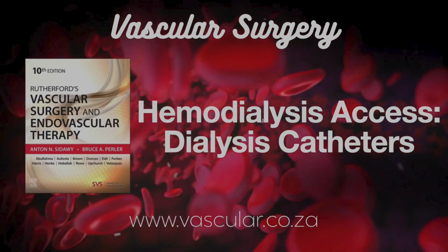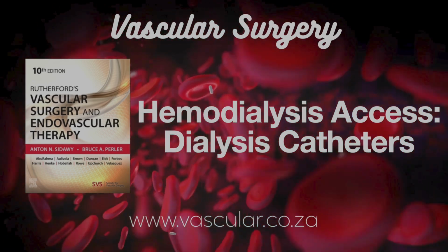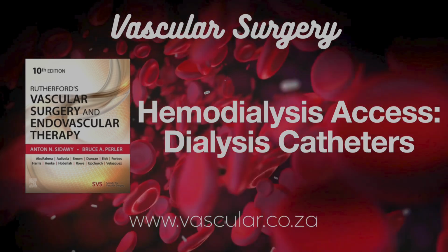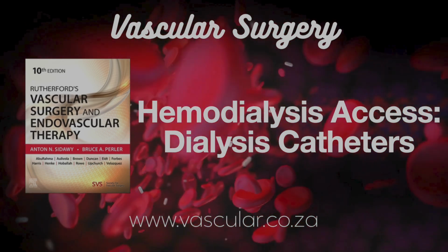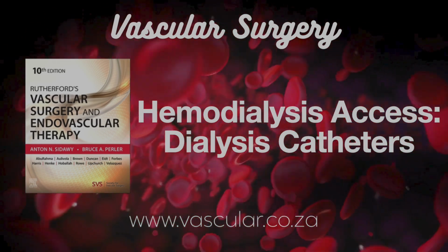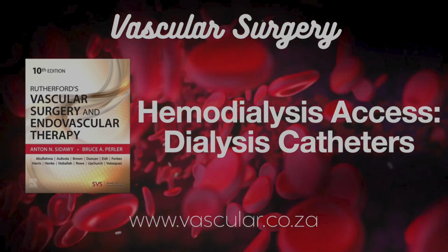Okay, let's move to right after the procedure. Perioperative care and dealing with immediate problems. Right. The main focus immediately after is watching for and managing any acute complications. The overall risk isn't huge, maybe around 7% reported for central lines in general, but you need to be ready. Failure to place the line and hitting an artery are common issues, followed by things like pneumothorax.